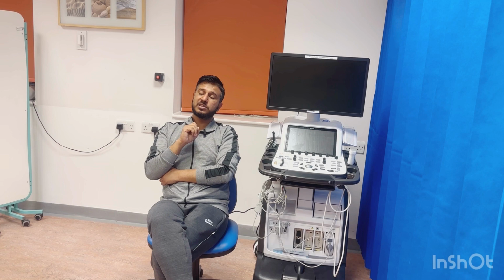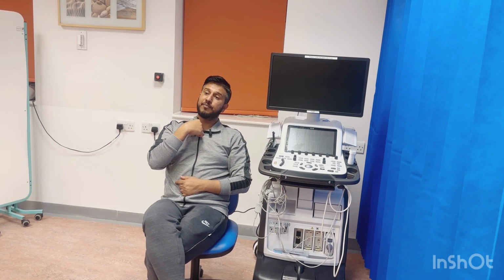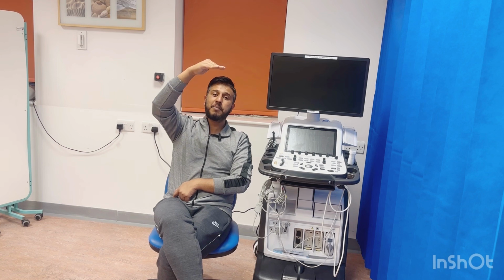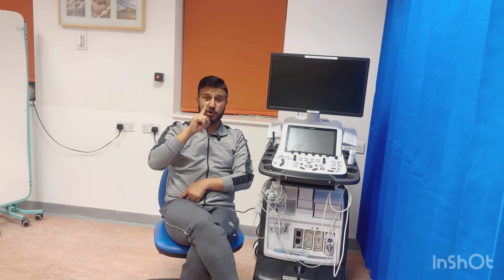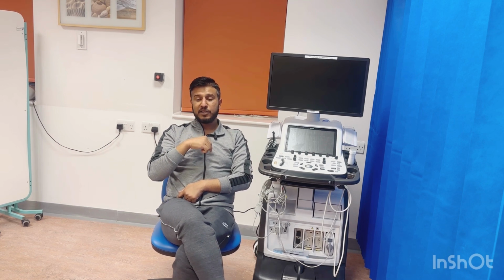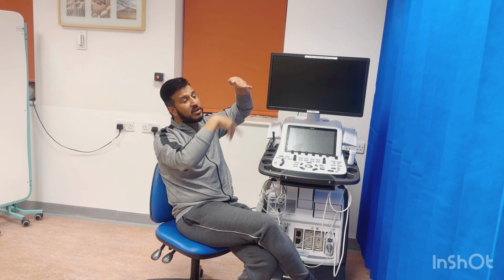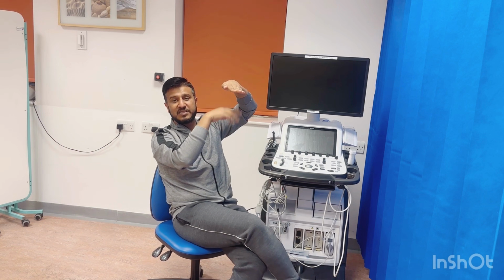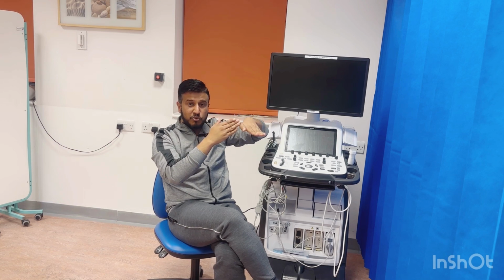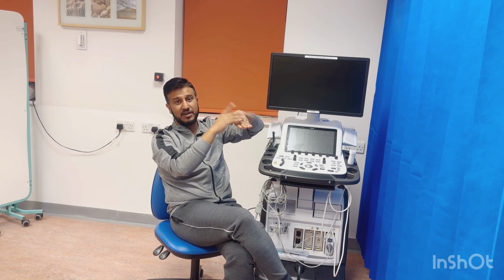Keep one thing in your mind, which most of us, even myself, make as a mistake. Once you are putting the Doppler in your descending aorta, you are going to see the reversal above the baseline. That's the first point. What we do is we put the Doppler in the descending thoracic aorta, okay, and our baseline is very high, and we are only seeing the flow below the baseline, which is the systolic flow. If we need to see the flow reversal, we need to bring our baseline down so we can see the flow above the baseline, which is our reversal in diastole.